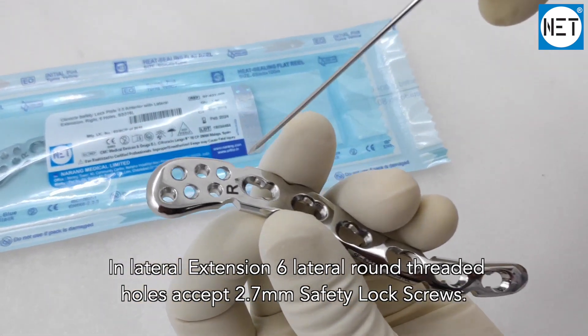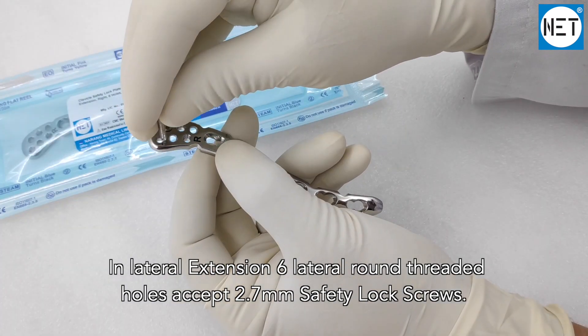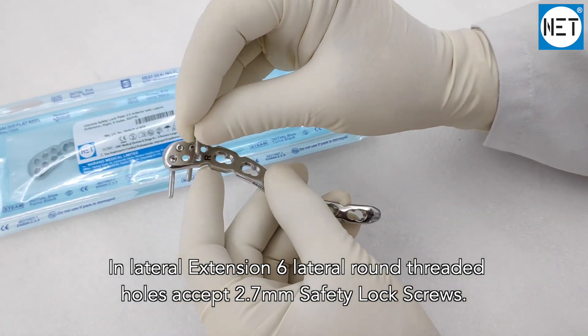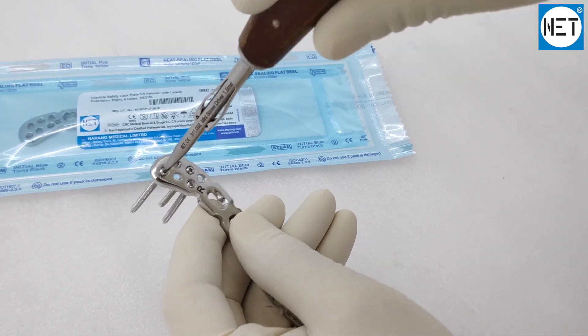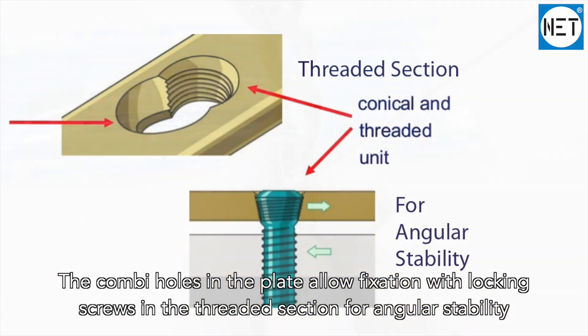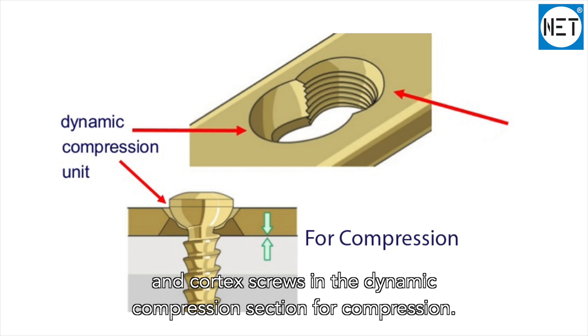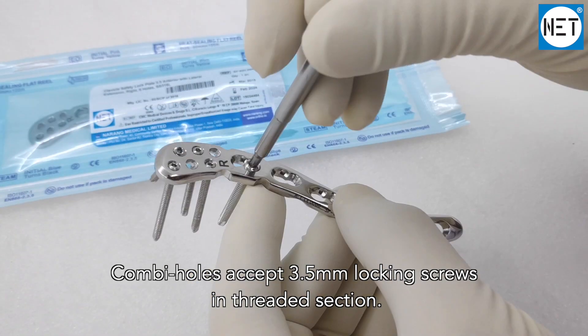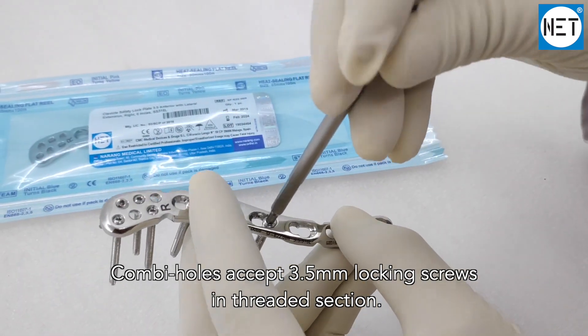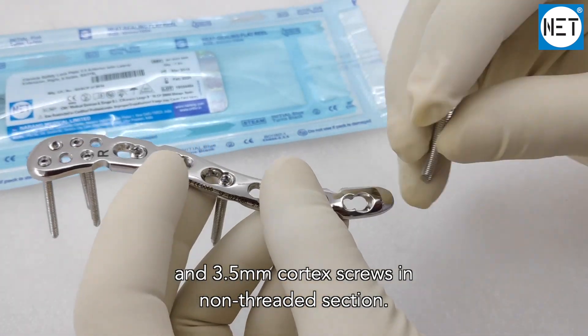The lateral extension features six lateral round threaded holes accepting 2.7 millimeter safety lock screws. The combination holes in the plate allow fixation with locking screws in the threaded section for angular stability, and cortex screws in the dynamic compression section for compression. Combination holes accept 3.5 millimeter locking screws in the threaded section.